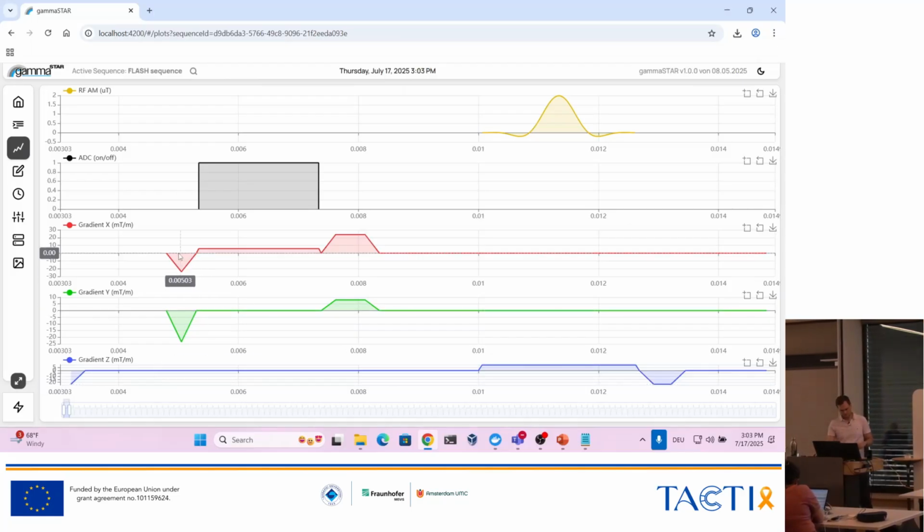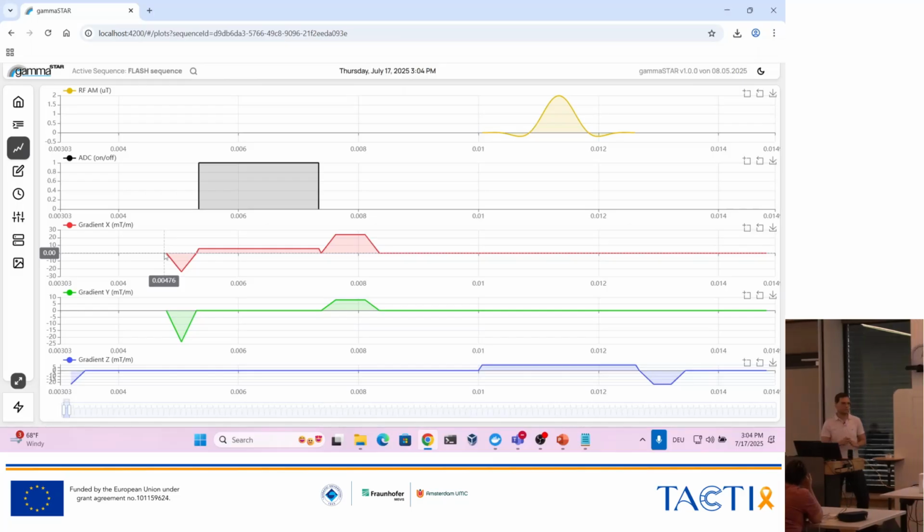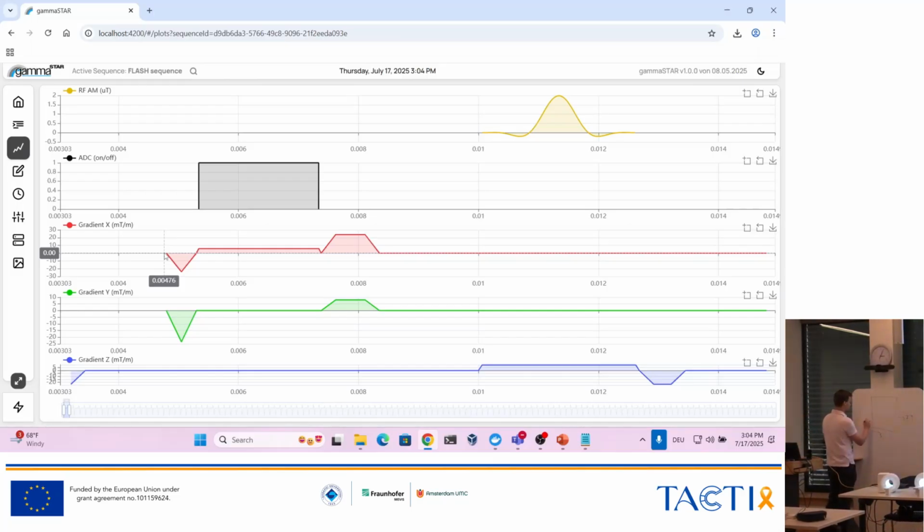So we can handle the gradients just as helping us to go to different positions in K-space. So we can just read it from left to right. So we start here. We have no gradient after the RF pulse, but now we introduce a gradient in X direction and in Y direction. So this would be X, this would be Y. We start always in the middle of the K-space center, and then we have these two gradients, X and Y, so a diagonal traveling through the K-space. So we will just end here.